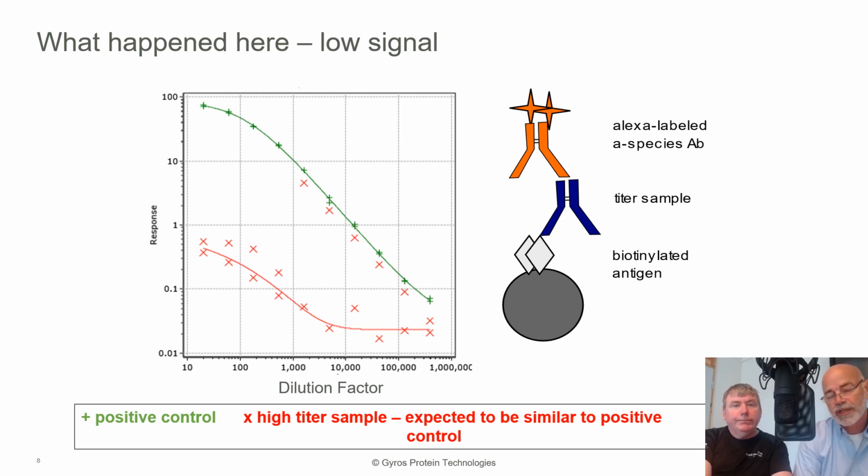The first step would then be to take a look at the table and see if we can see any patterns of needle usage or patterns on the CD that are suspicious. The good thing is that the software can be used to see this information. So this is important for the diagnosis of issues.